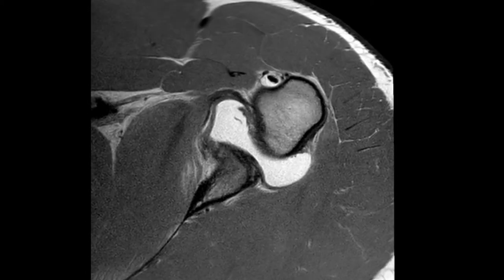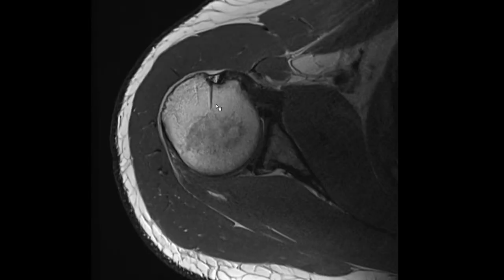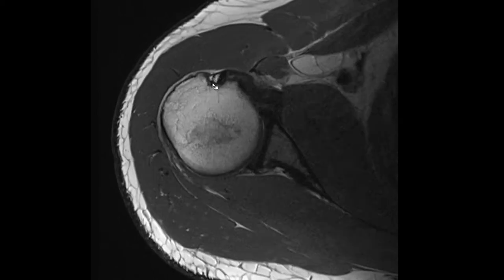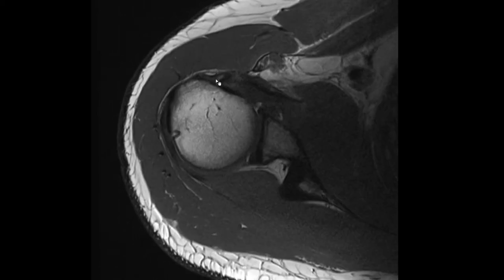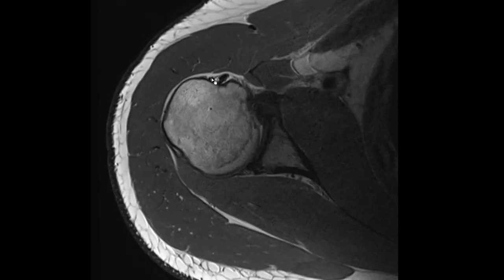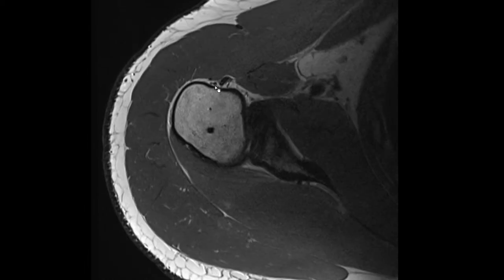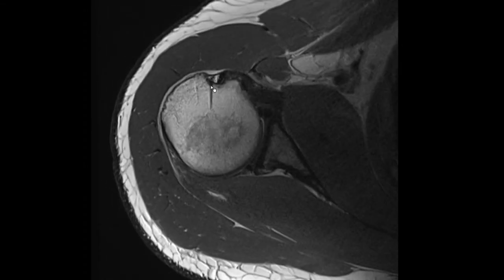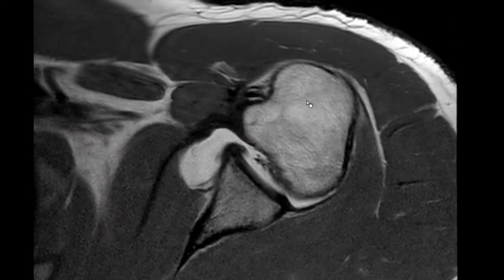This is also just a normal structure that should not be mistaken as pathology. This is a very nice case because you can see how this vessel enters or exits the bone, coming out, and you can see how these two dots are running down on the surface of the humeral bone. This is just a normal vessel, nicely depicted with its intraosseous part.